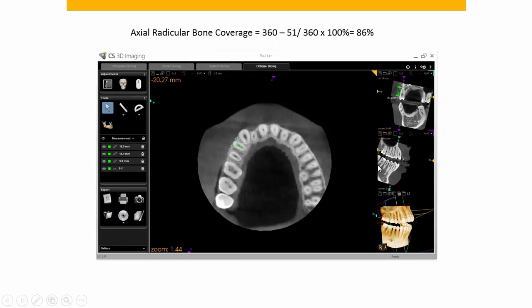We take a measurement halfway between the lowest and highest vertical bone heights, and that's where we take a slice perpendicular to the long axis. Using the angular measurement device, we do three clicks — that gives us the degrees of defect. In this case it's 51 degrees, so: 360 minus 51, divided by 360, times 100 percent equals 86 percent. That means 86 percent of that tooth's circumference is covered by bone. You can have multiple defects on facial and lingual — then you take the sum of the defects: 360 minus the sum of defects.